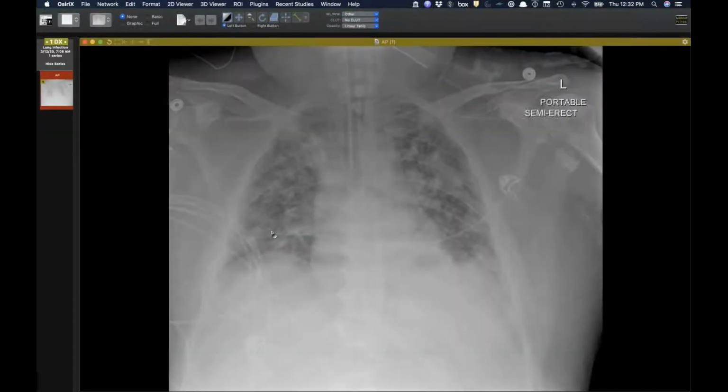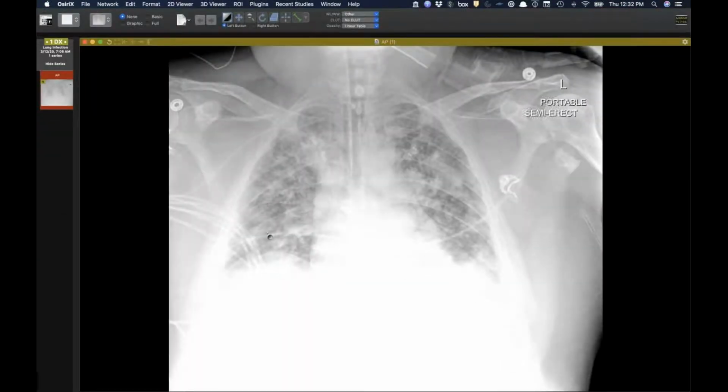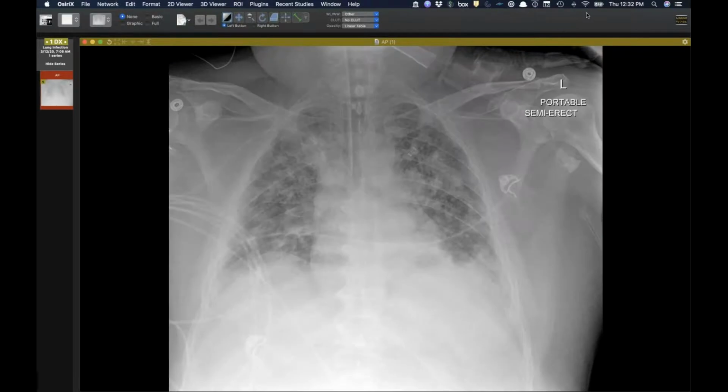You guys see a radiograph that's now slightly better windowed? So yeah, this is a 46-year-old who is one of our first confirmed cases. And much like David said, we're not getting CTs in these patients, but I show this because this guy's teetering on the brink of ECMO at this point, and was sick for 2 weeks in the community and has no known contacts, no travel. So of course, this just looks more like lung injury. Some of the areas are a little bit more nodular. Was asking if they thought he had a superimposed bacterial pneumonia, and they said no. So this is a confirmed COVID radiograph of somebody who's deteriorating.